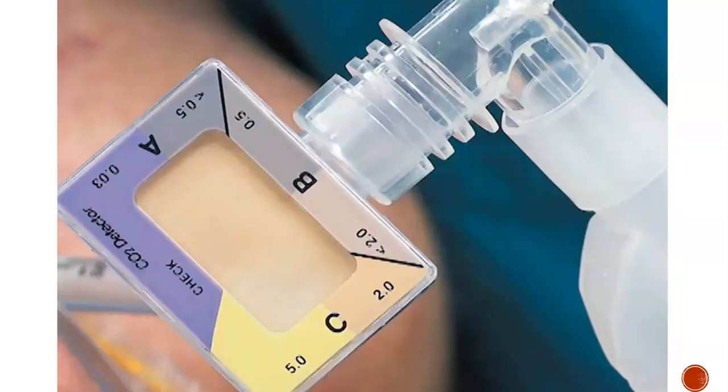So end-tidal CO2 is subtracted from the PaCO2, which gives us an index that we know as the PaCO2 EtCO2 gradient. That gradient is used to estimate the severity of pulmonary disease, and it helps us to determine the baseline correlation between that end-tidal CO2 and that PaCO2.